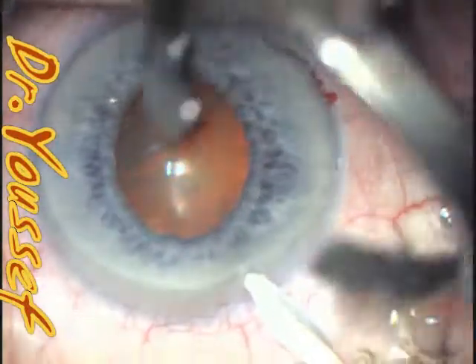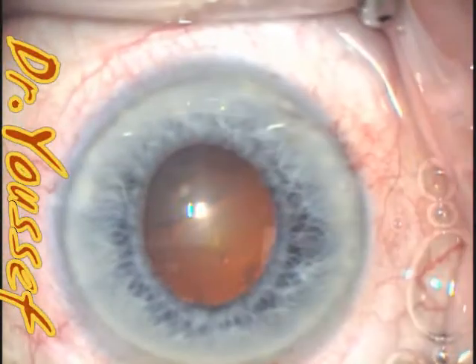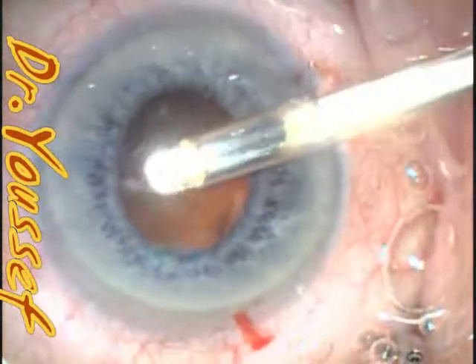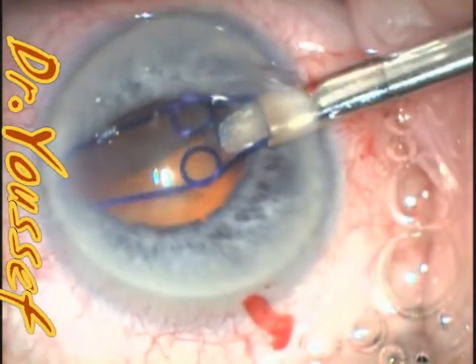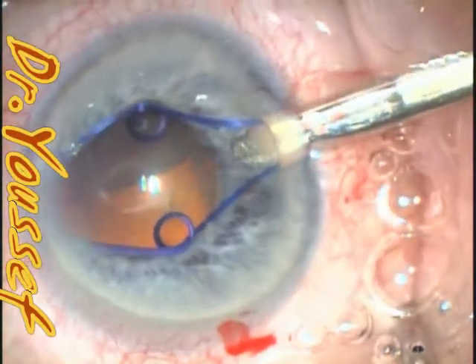The case started as usual: 2.75 knife, viscoat, then the paracentesis, and then I'm going to implant the Malyugin ring. So the nasal is engaged first, and then I move it a little bit and tilt it superiorly so that I can engage the upper part of the pupil.